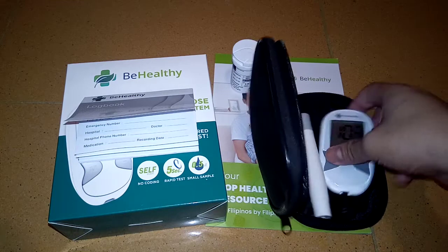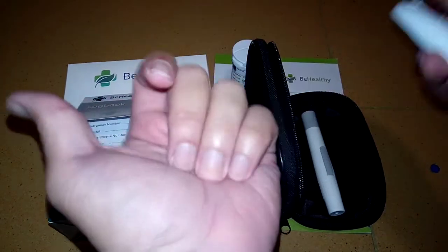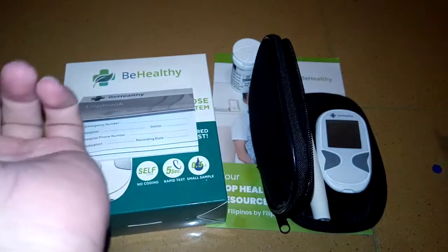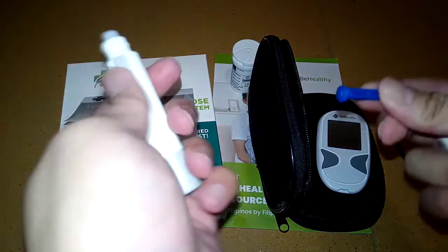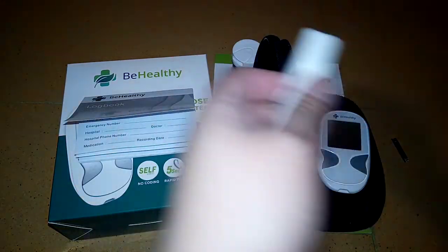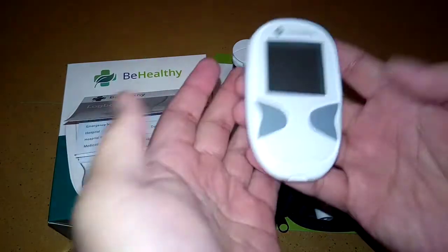That's it — this is from Be Healthy Philippines. When removing the strip, you just do it like this — you don't have to pull hard. Make sure to dispose of the needle properly: remove it from the pen, cover it with the cap, then place it inside an empty mineral water bottle as an extra precaution for safe disposal.